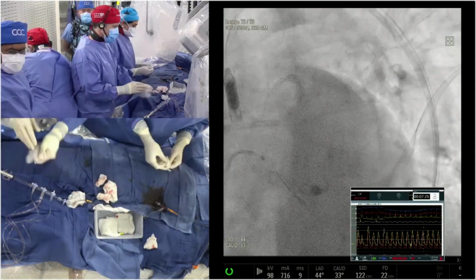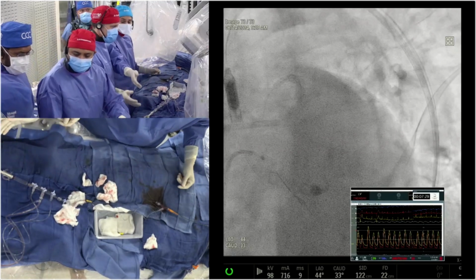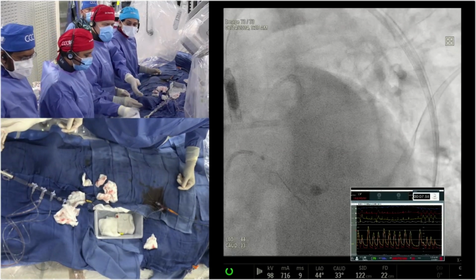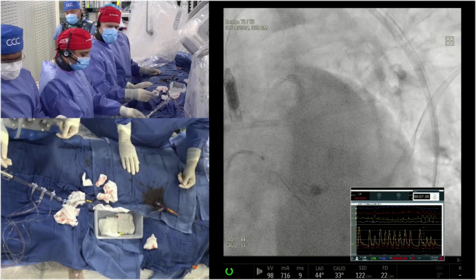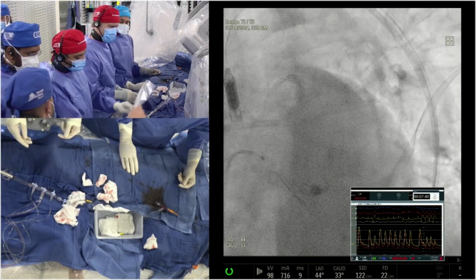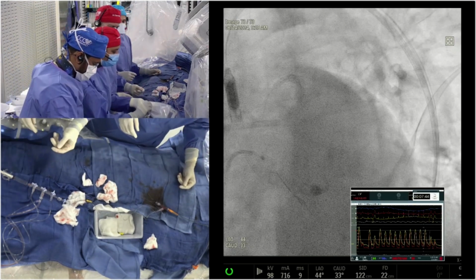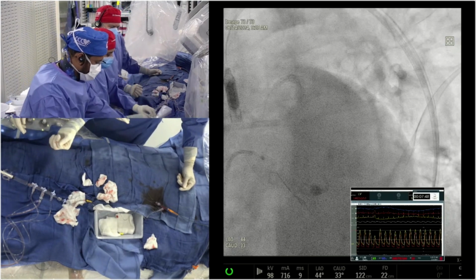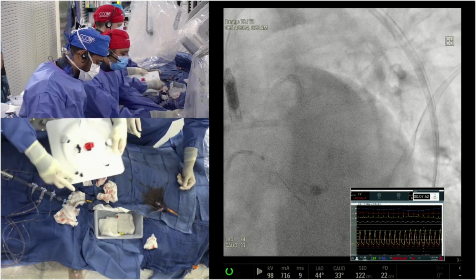Well, there's a lot of debate about that. People think that IVL doesn't work so well on calcified nodules, but it actually does fracture. It just requires more pulses. Part of that is because the emitter will be further away from the lesion, so it requires more pulses. And you don't have the reverberation that you have with a concentric calcified lesion, so you're not getting that augmentation. But it does fracture. It's just not going to fracture in multiple areas. It will fracture.